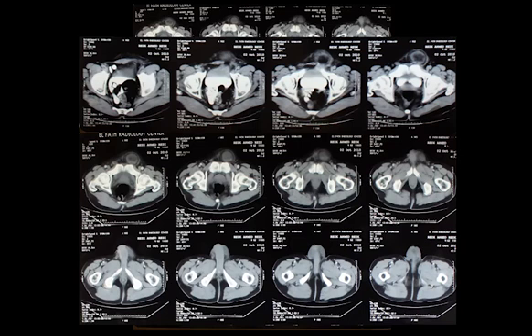And why is he doing a CT? Is it that important? I cannot answer you about this yet, Pradeep. If you've got the image already, probably we have not requested it. Maybe they were doing it for another reason. But if you've got it, then you show it in order to consolidate theoretical knowledge. At times we use CTs, but probably the CT was not indicated in this situation. In real practice it may be malpractice, because they may sue us. This is just a hernia, so why do a CT?